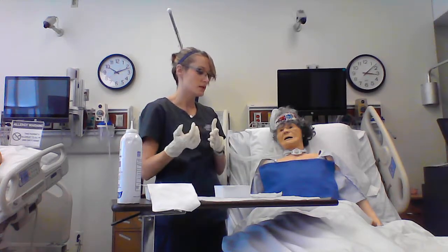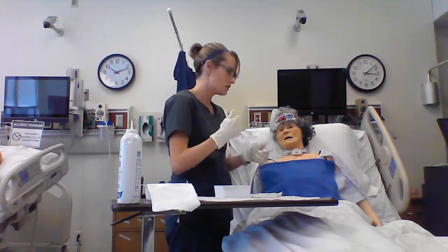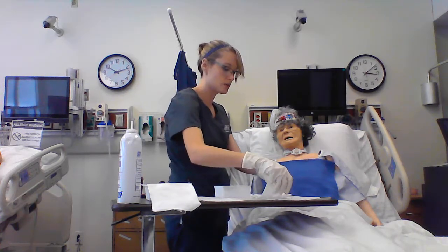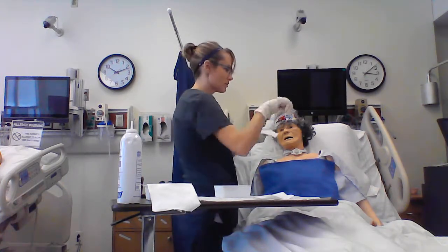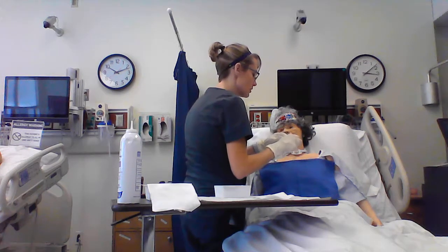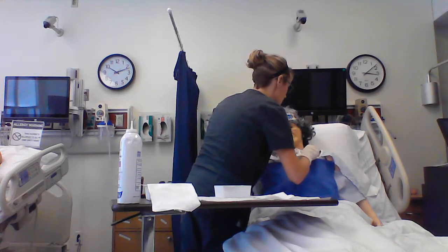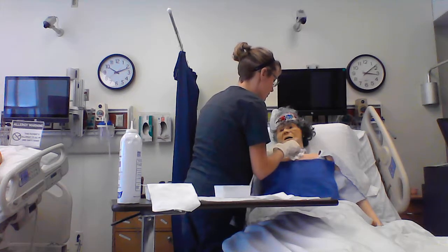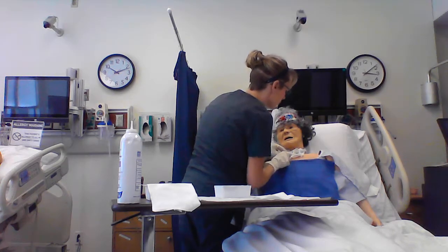So doff these, and then don a new pair of sterile gloves at this point in time, performing hand hygiene between gloves, so that you can insert a new V-sponge for her. So sterile again, I would get my V-sponge out of my kit here with a Q-tip. That's how I like it. You could also use sterile clamps to help insert these V-sponges, but just stay as clean or as sterile as you possibly can doing this for your patient. So we're going to go up under the trach tie collar here, and then wrap this again, and I go up under the other side of her trach collar.